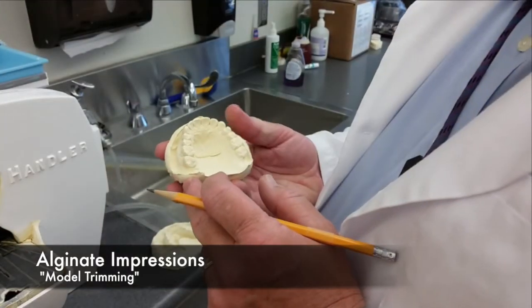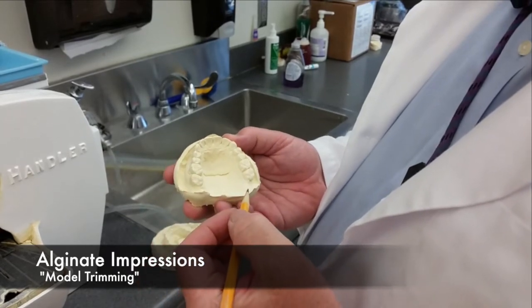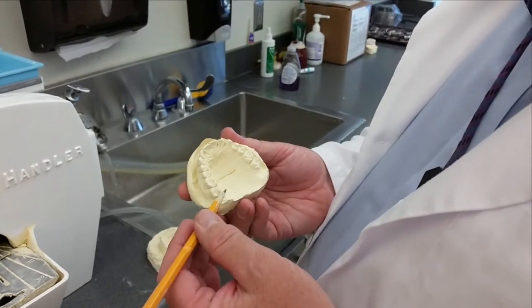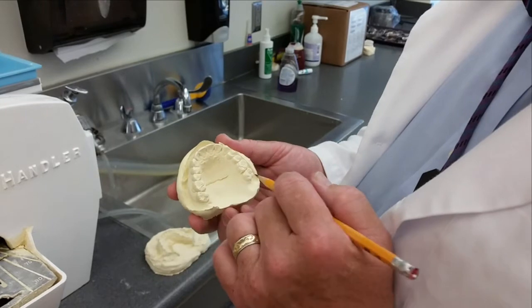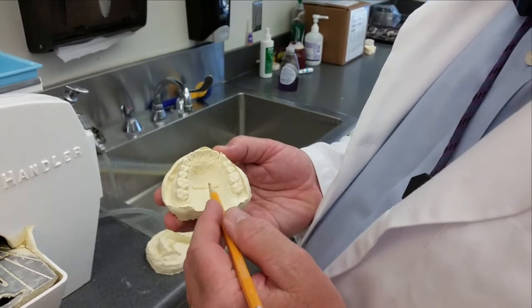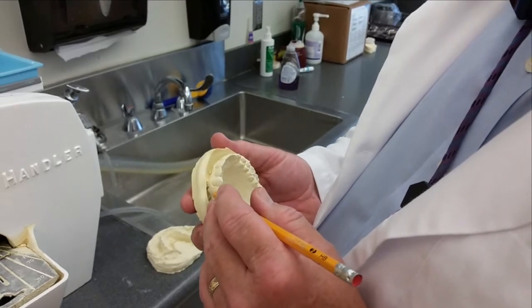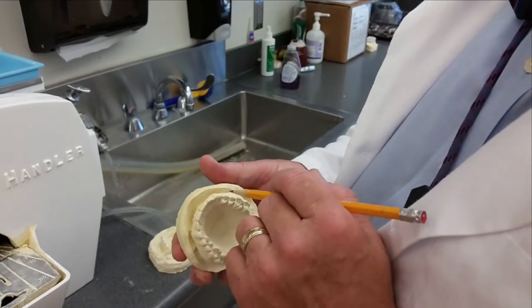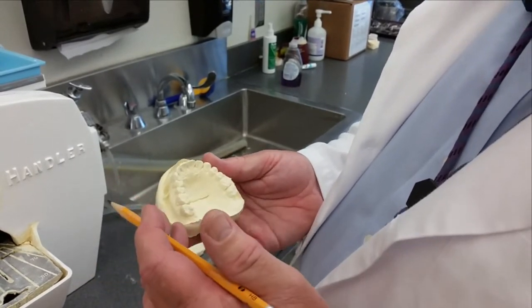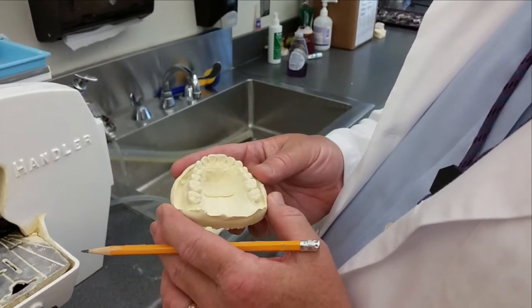So we now have the set model poured in stone of the upper alginate impression. We notice that we have included the hamular notch area and the tuberosity. We have all of the teeth with no bubbles, no flaws. There's a small flaw here that can be easily corrected with a number 7 spatula, and we'll show you what that is. The vestibule is clearly captured in the impression and reflected now in the stone model. And we have sufficient excess that we can trim the model to have a nice strong model for lab purposes.